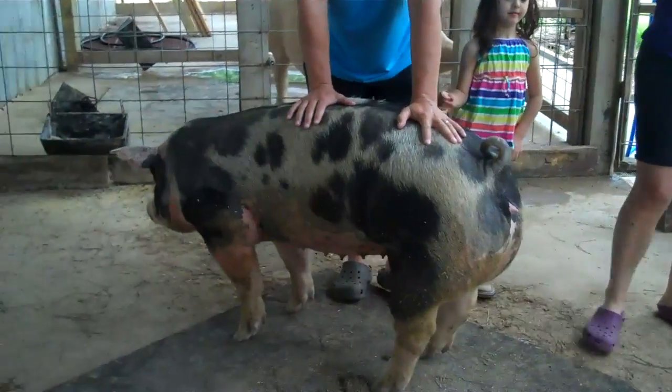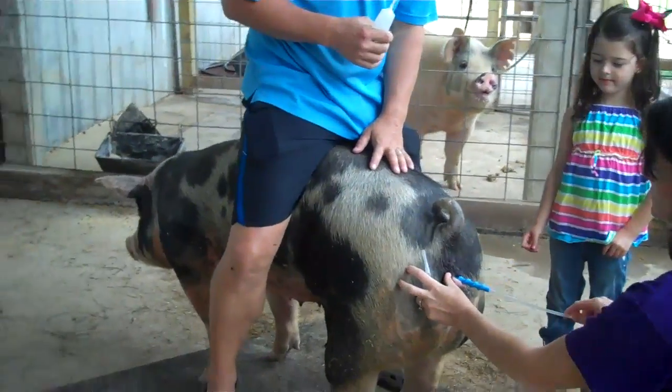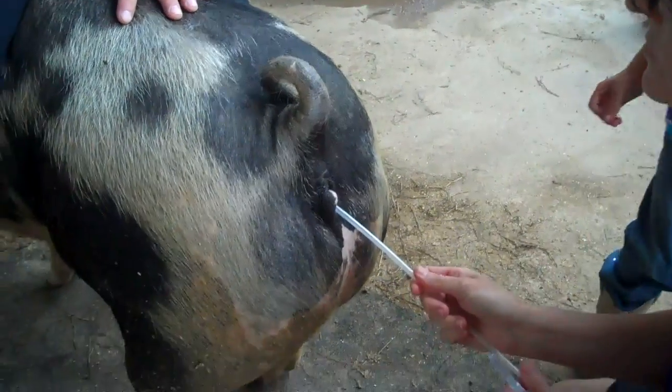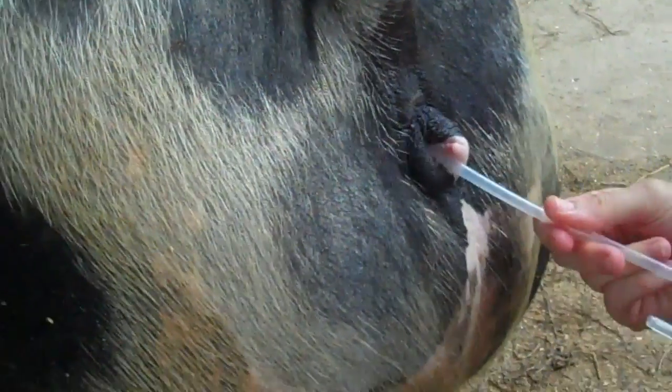And the semen — the breeding tube — did you lubricate it? Yes. So counter-clockwise, we're screwing it in counter-clockwise until it locks into the cervix.